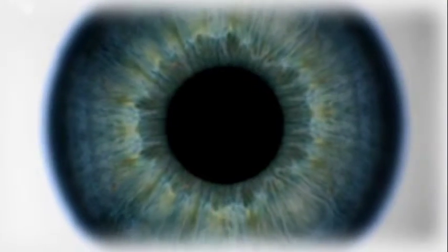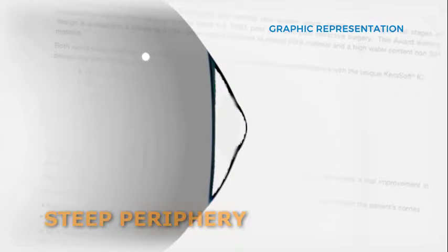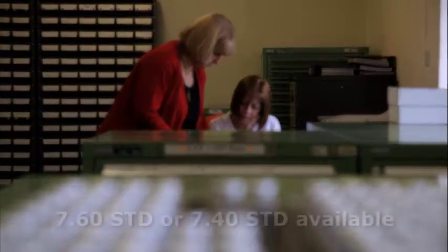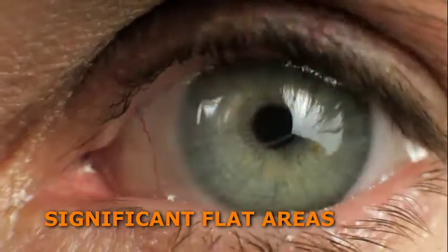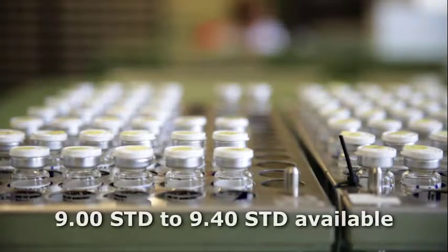First, let us look at when it is appropriate to order standard periphery diagnostic lenses outside the range of the diagnostic set. If the advanced central ectasia has a steep periphery, all lenses in the diagnostic set may be too flat and even lift off or flute at the edge. For these cases, standard periphery diagnostic lenses with base curves of 7.6 or 7.4 can be ordered for fitting trials. For corneas demonstrating significant areas of flattening, even the flattest lenses in the set may show air bubbles or tight fitting characteristics. Here, standard periphery diagnostic lenses of base curves 9 to 9.4 can be ordered.